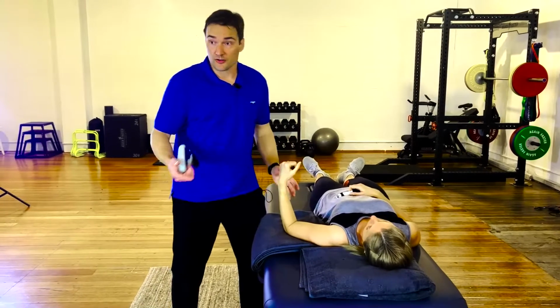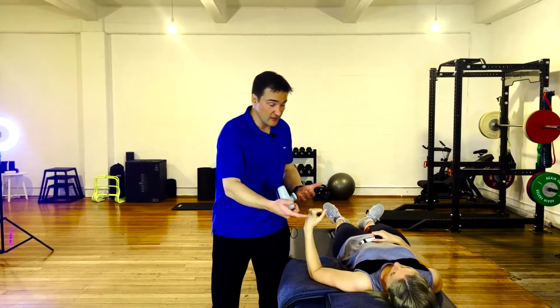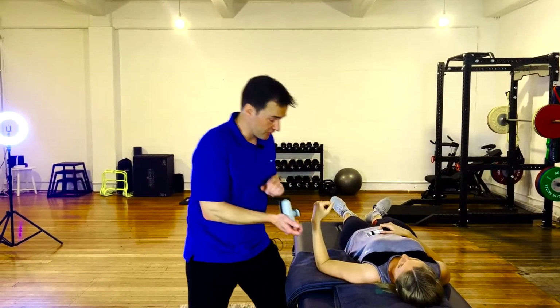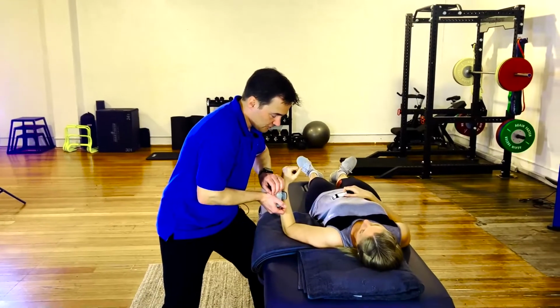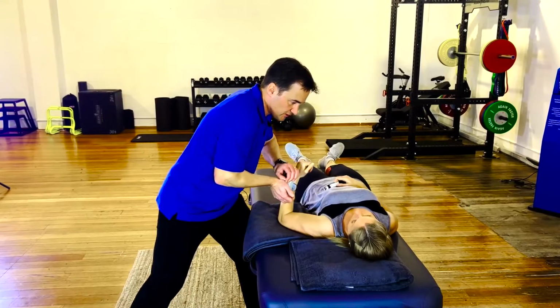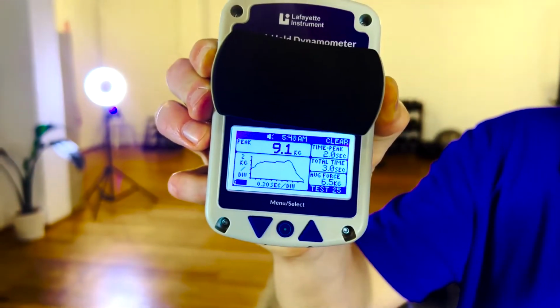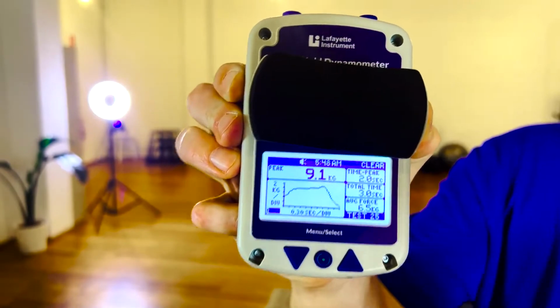I guess Susanna made a point on the previous prac as well about safety and about potentially if someone has a joint that's irritable, or if it's a rotator cuff repair, you're introducing an eccentric component there. They're all things to think about within your own clinical reasoning. But if we just demonstrate what we're talking about here, you're going to match my resistance, 3, 2, 1, come on, push, push, push, push, push, push, push, and eventually to break them, if you look at the peak there, and I don't know if you can see it on the camera, the peak at the end is associated with me breaking Susanna.